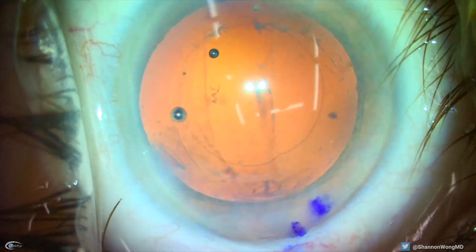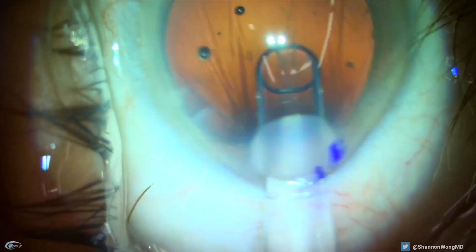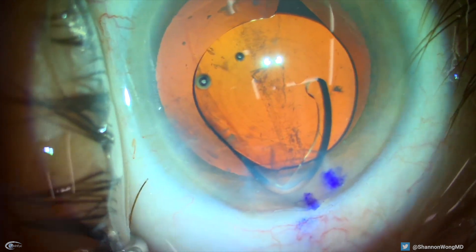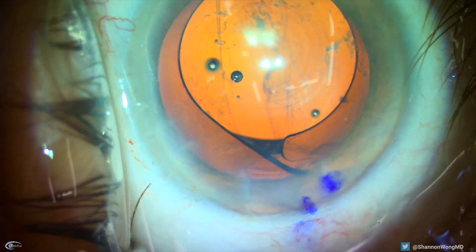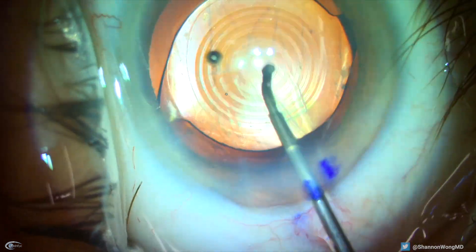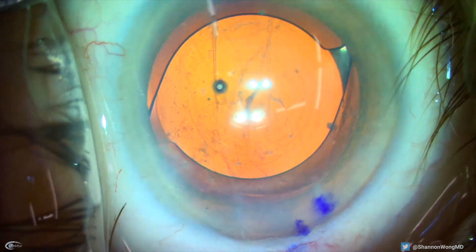We make sure that we have a generous amount of viscoelastic — in this case Ocu-coat — in the anterior chamber. Then we gently and slowly insert the IOL with the leading haptic into the capsular bag. Then we place the trailing haptic into the eye, push more viscoelastic into the anterior chamber, and gently rotate the haptics to be perpendicular to the vertical tear in the posterior capsule.